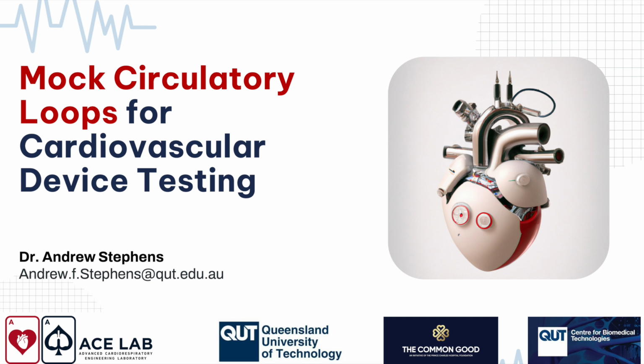You can also develop compliance chambers with very high compliance on the venous side by just leaving the compliance chamber open to atmosphere. In this case, the compliance doesn't have a curve, it just has a single value, and that single value is represented by the diameter of the chamber. The reason for that is that the compliance is determined by the cross-sectional area as well as the height of fluid. Oh, sorry, the density of fluid. So that's what we call a passive compliance chamber.